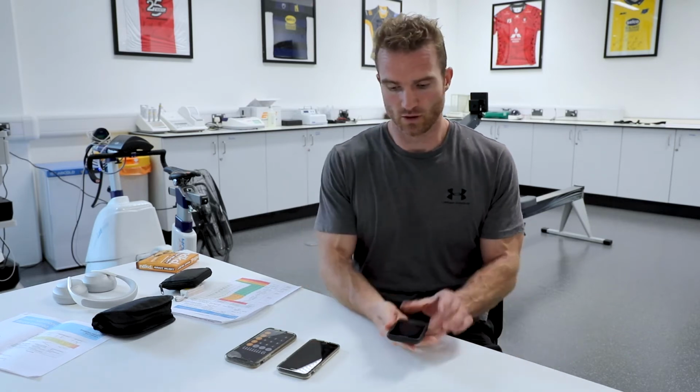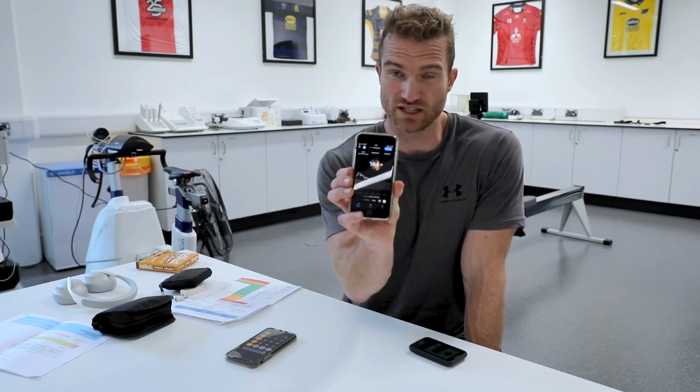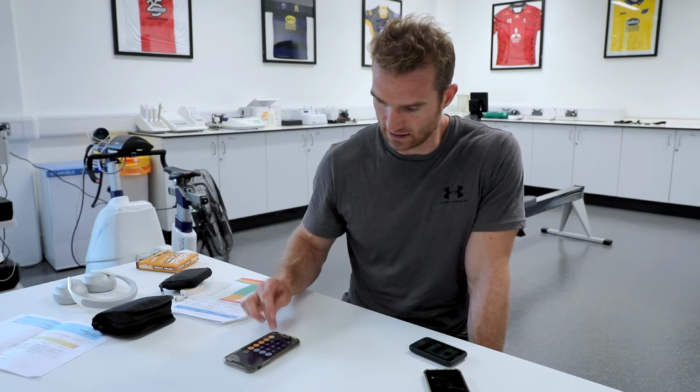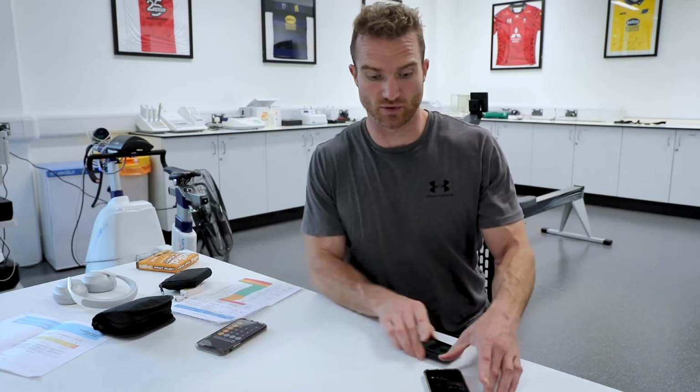So just about 5 minutes away from starting the activity. I've reduced the insulin dose by half. And the first thing we need to do is check the glucose before starting and see whether that reduction's worked or if my glucose level is below 7 and requires some supplementary carbohydrate. At the moment, the Dexcom is reading 8.3. The Super Sapiens is reading 164 milligrams per deciliter. And to get a millimoles per litre reading, you just divide that by 18. So 164 divided by 18 is 9.1. So we've got 9.1 and 8.3. We'll see what the finger prick is and we'll see what the lactate is also.